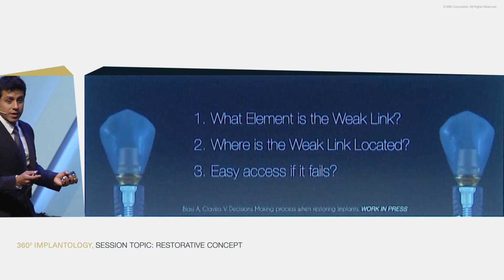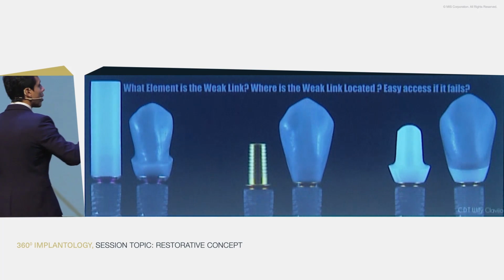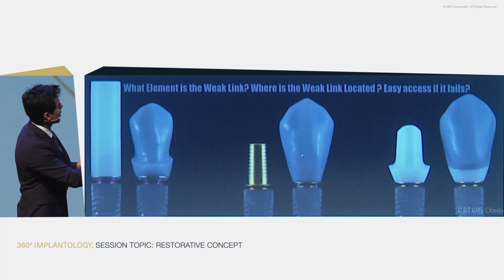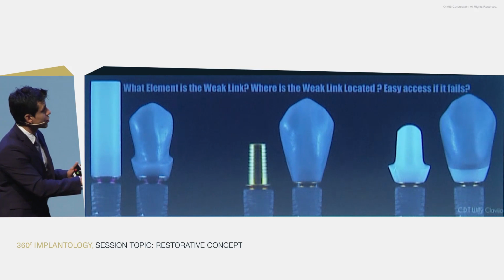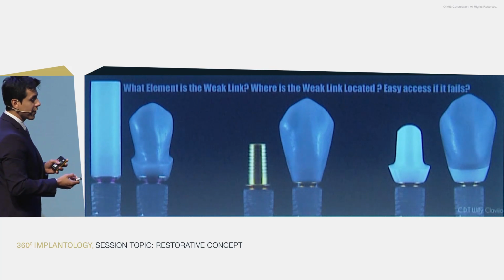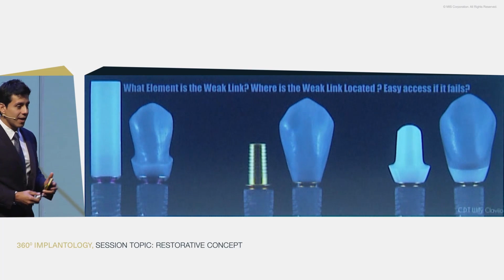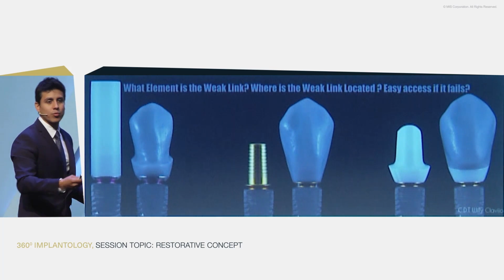With cement, zirconia or disilicate on top of the T-base, where is the weak link located? And if we have some failure, how can we manage this failure? With the normal options for posterior restorations, we can do cast metal restorations, we can place zirconia on top of the T-base, or we can use the prefabricated zirconia and place monolithic disilicate on top. And now you have to think, where is the weak link? Because if you work with metal, the weak link probably will be a chip on the layered ceramic part. And if you have a chip in a metal restoration, you have to replace it.